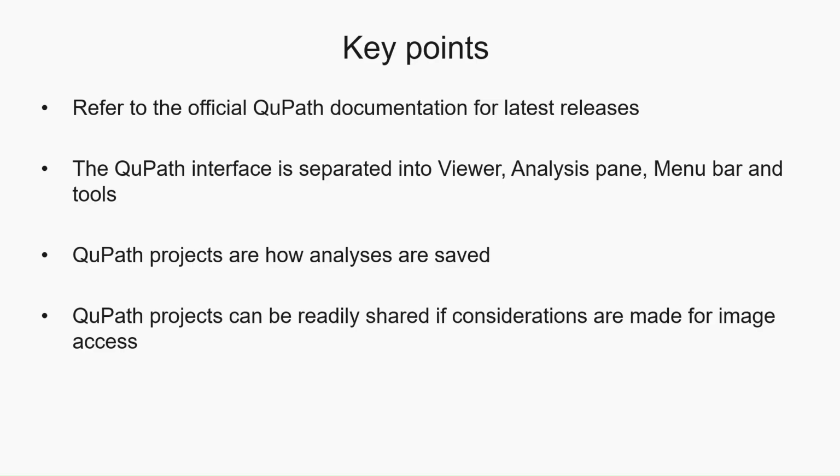The QuPath interface is broadly separated into the viewer, where we can view our images and interact with our images, the analysis pane, which relates to our QuPath project, and then tools within either the menu bar or the icons along the toolbar. QuPath projects are how we save our analyses, and also these projects are readily shareable with others who wish to access our analysis.